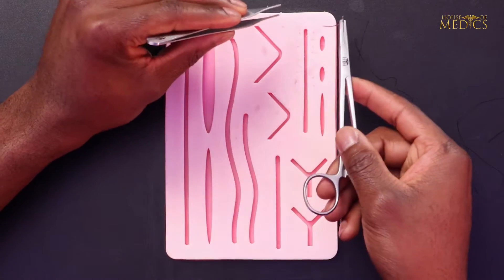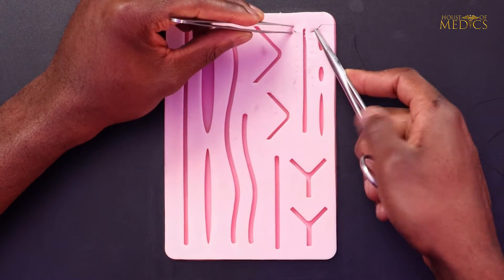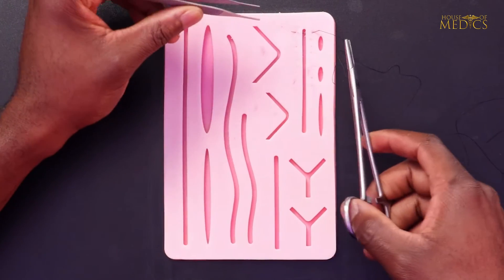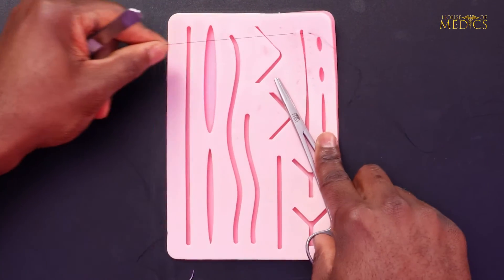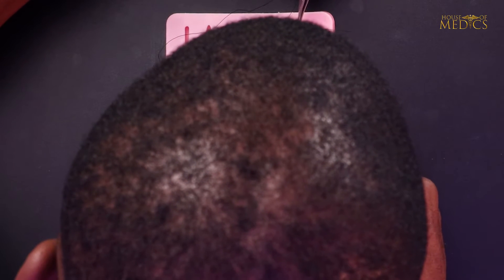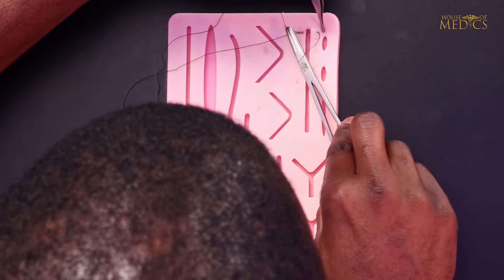The first part of most running sutures is some sort of anchor suture. In this case we simply throw a vertical mattress suture, so you start on one end of the wound, pass your needle at 90 degrees to the skin, rotating your wrist all the way across to the other side. This is your far-far throw. Then you remount your needle in a backhand fashion to throw a near and near throw.